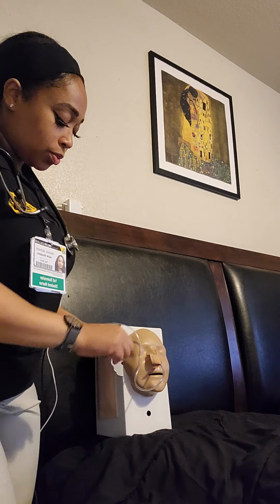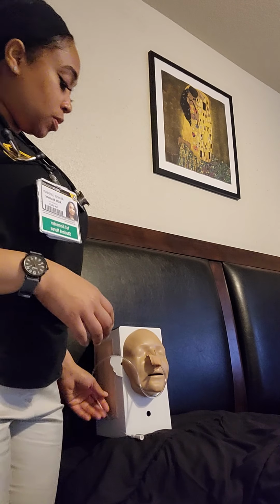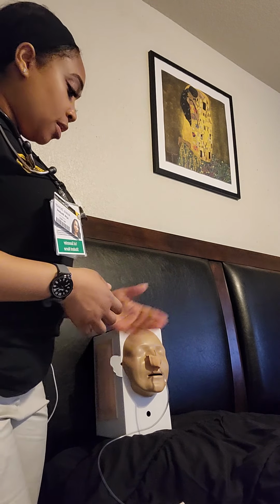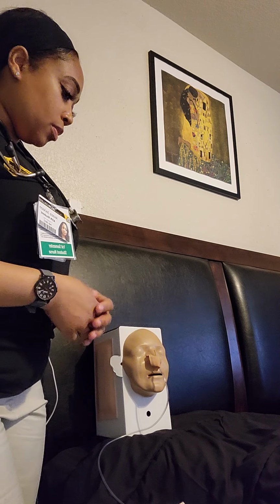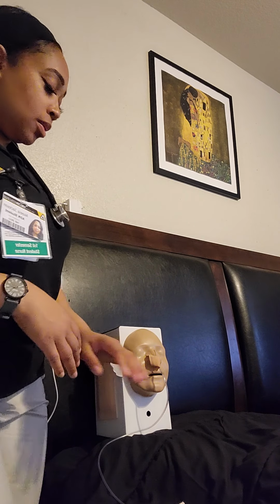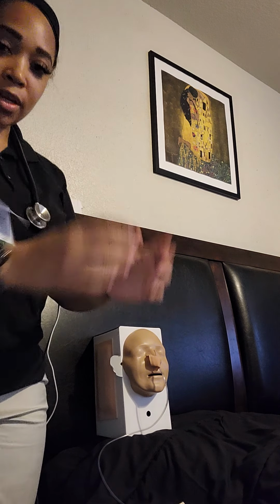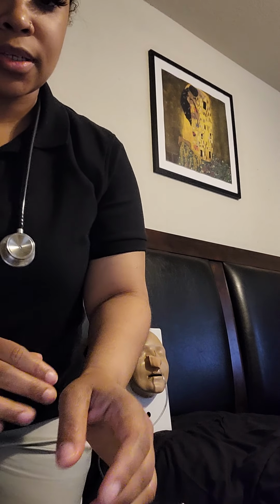Afterwards, I'll document my findings, make sure the patient is in a comfortable position, note for pain, make sure the patient's belongings are in reach, make sure the bed is at a low level and the bed alarm is on, and perform hand hygiene upon exiting. That's it.